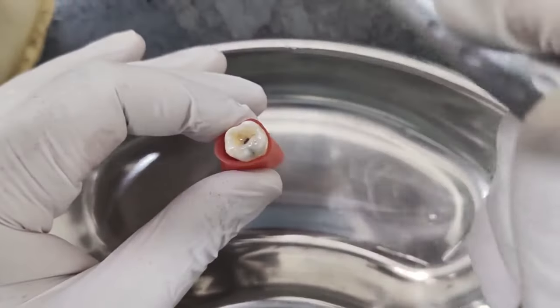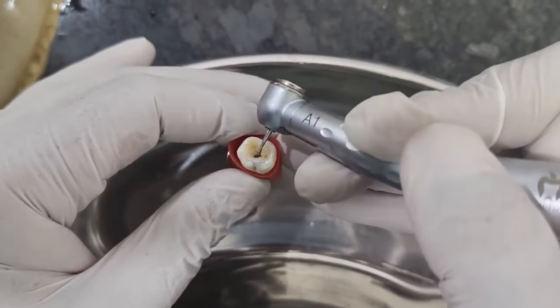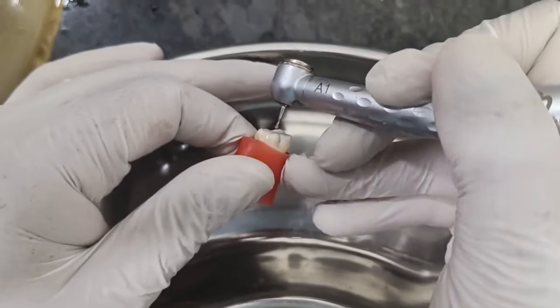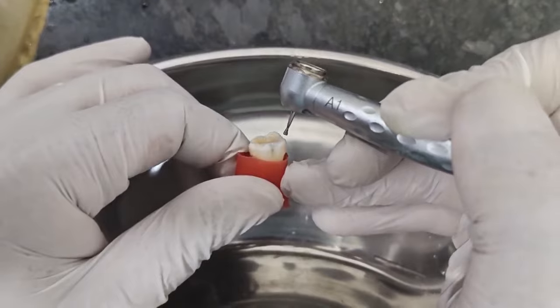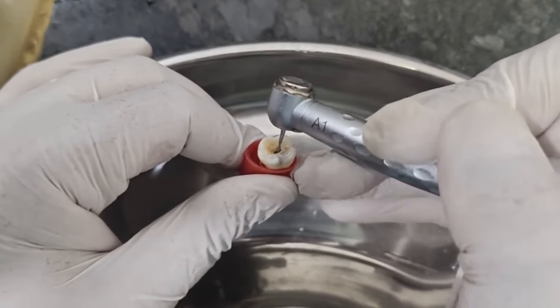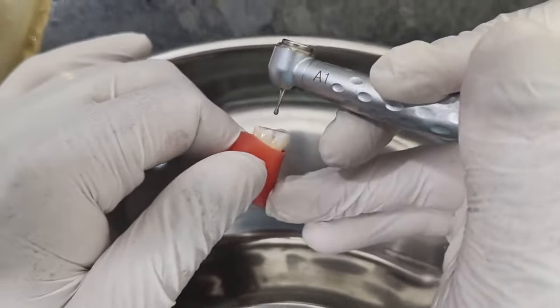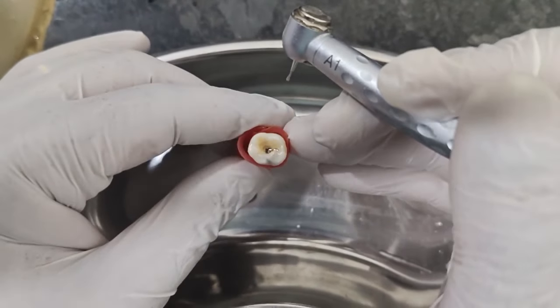So now we are doing the access opening for the lower molars, and here we can use a round burr or inverted cone burr for the initial dip. This is a tooth already covered with wax, and I had earlier shown how many roots. This is the lower molar, so there are two roots with three canals or maybe four canals. So now we will make the initial dip. I will show you from the side and superficial surface as well.